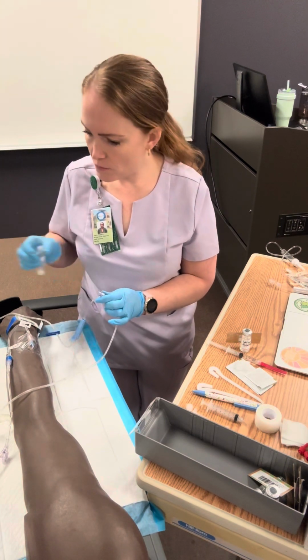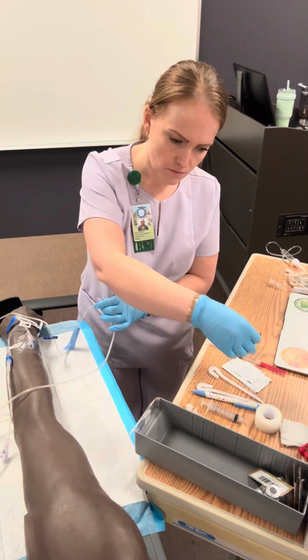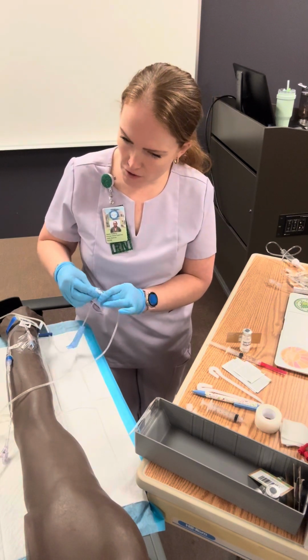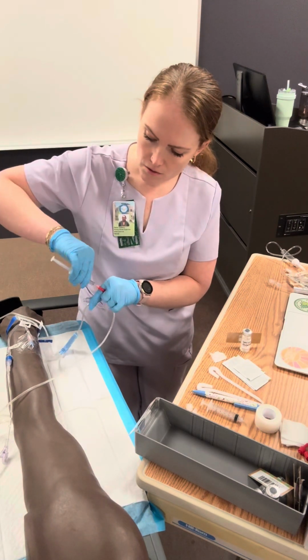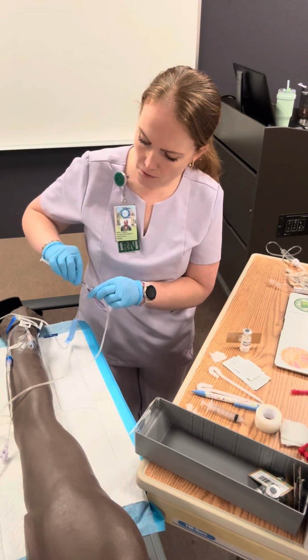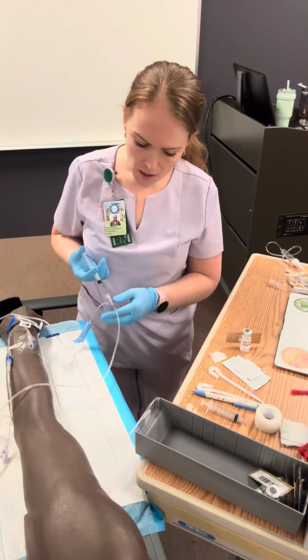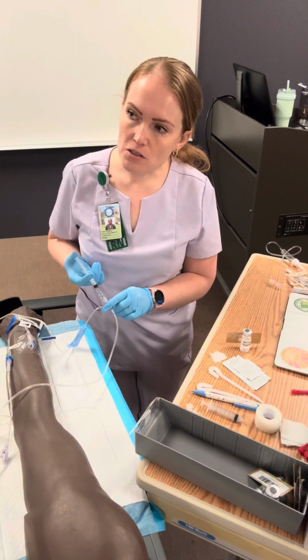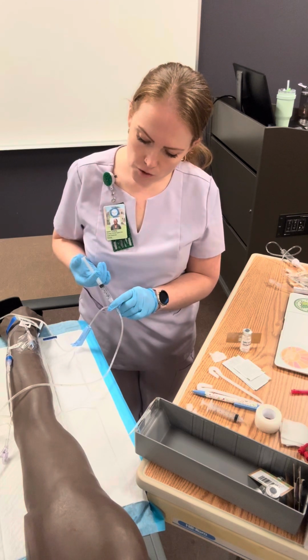I'm going to remove that, set that off to the side, and grab a fresh alcohol pad and clean. That felt okay. All right, grab up our medication, remove this needle, which will go into the sharps bottle. Now I'm going to take about a minute infusing this. So I'm going to watch my second hand and we're going to go nice and slow, because certain medications you don't want to go too fast. Some medications are very specific on how fast or slow you administer them.